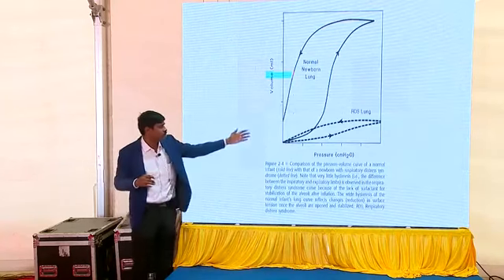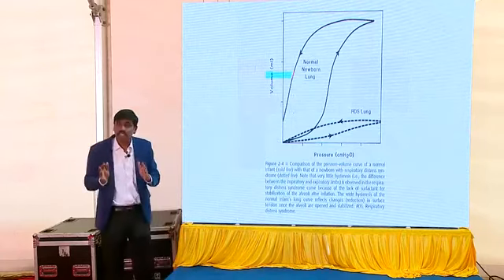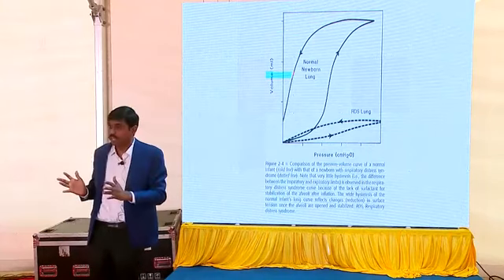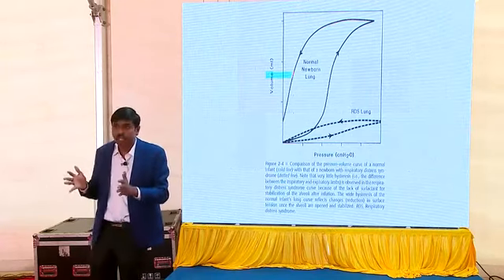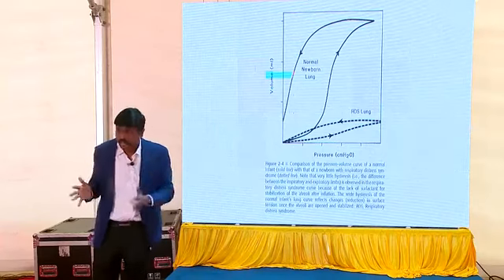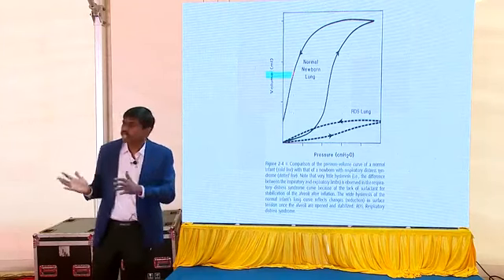In fact, this is a baby who had RDS, then you had given surfactant, and that's better. So this is a baby with RDS. What I want to say is, have a habit of looking at the curves when you're starting to ventilate. Over time, you realize how it is happening and you find the response, because just numbers or just putting a tube inside the baby doesn't finish our job. Keep an eye on the baby as well as the curves as the baby goes forward, and you'll find that the curve gets better.